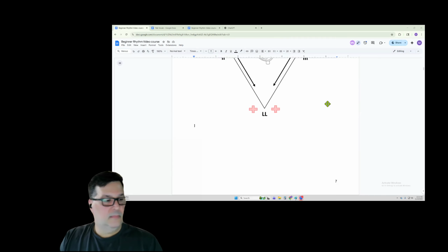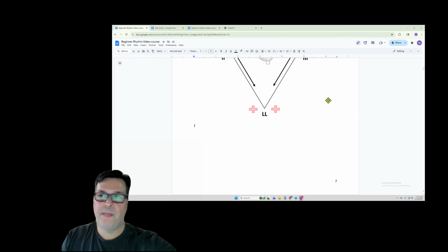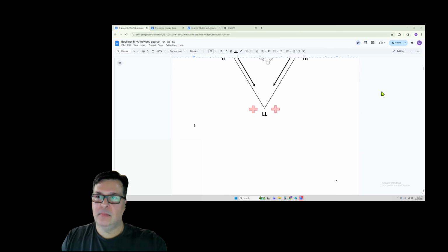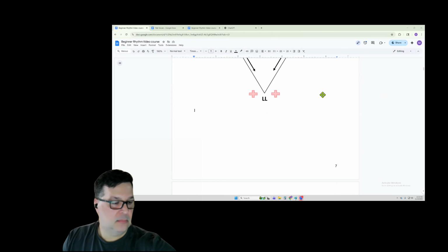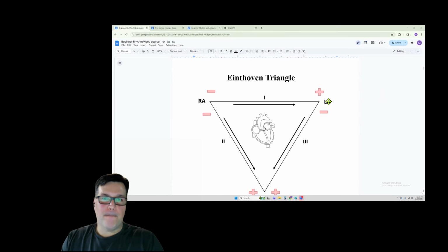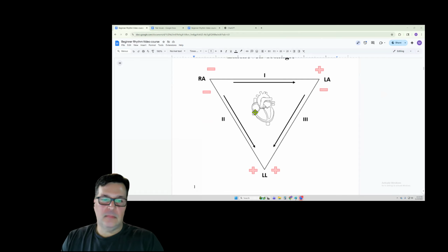Yes, the technical policy is that they should be coming off because every patient in the hospital is supposed to get what's called a CHG bath. It's special wipes. When that happens, it's everywhere on their body, and that includes underneath the stickers. So they're supposed to be changed every single day. And hair grows back. So the hairy chest guy that you had to trim to get that V lead that Jeff was just talking about, that hair doesn't stop growing and it's going to come back. So you've got to take those leads off and see, do we need to trim again?